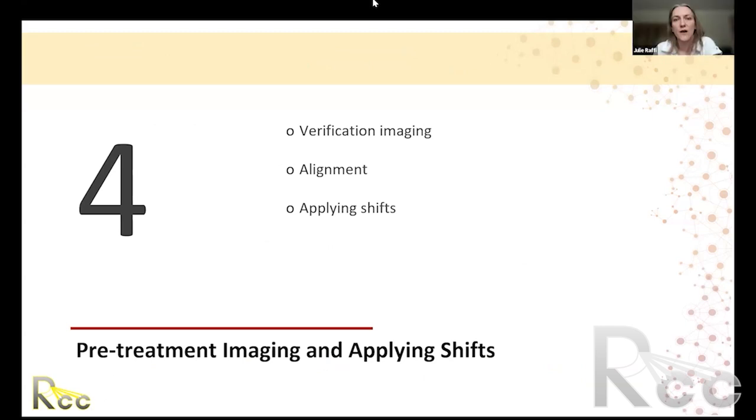So if you know what the distance is from isocenter to the gantry, you can measure using a digital measuring tool in the treatment planning system. You can measure from isocenter to whatever that distance is. It's about 40 centimeters for our machine. And so you can measure 40 centimeters around isocenter and see if the gantry is likely to collide with the patient or table or immobilization device.